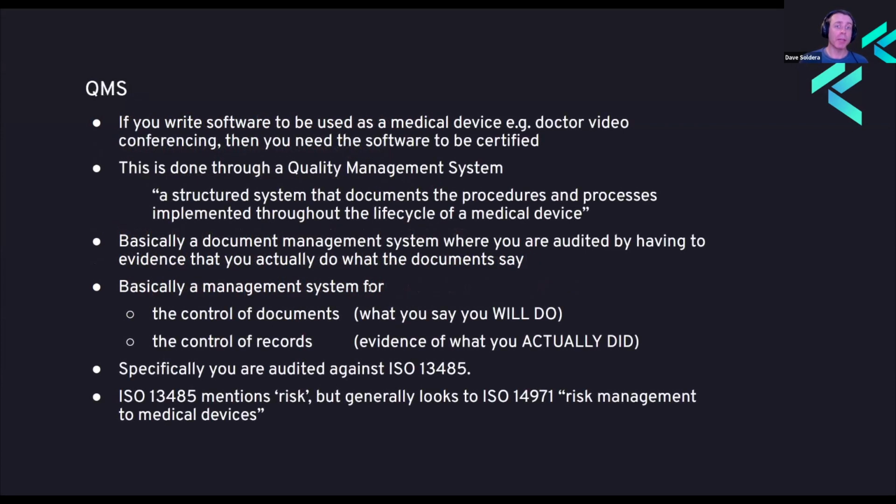So my threat modeling had begun, but this was really when the worlds of software as a medical device and threat modeling collided. If you're not sure what a medical device is, it really can be anything. It can be your pacemaker if you've got a heart condition. If you wear glasses on your face, spectacles, those are a medical device. And examples of software as a medical device would include video conferencing software with a doctor, right? And if you have a medical device, it needs to be certified.